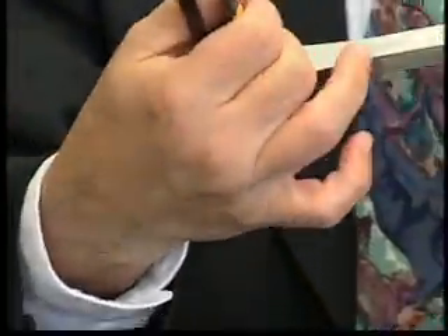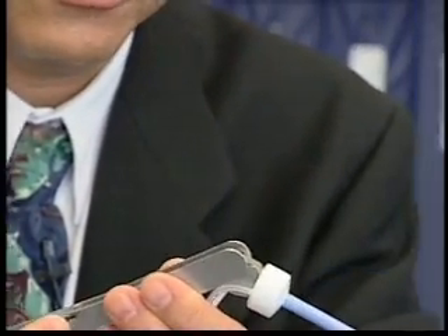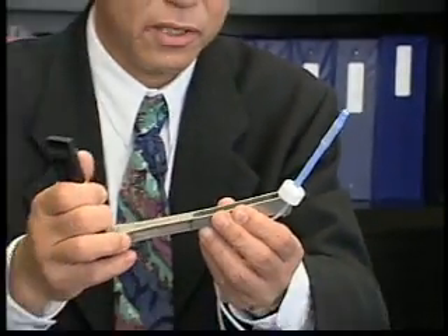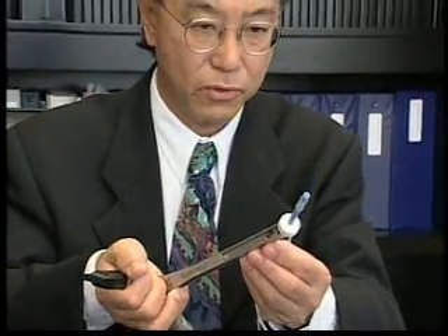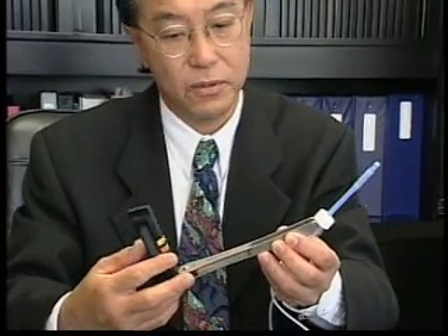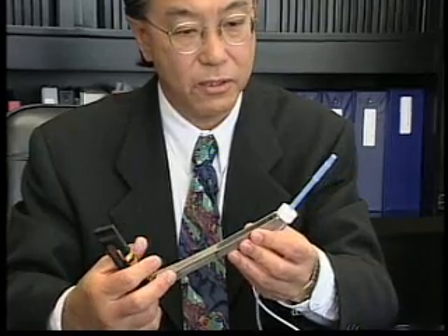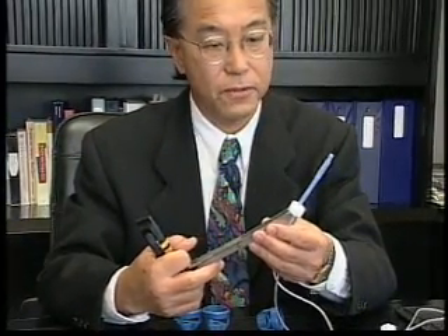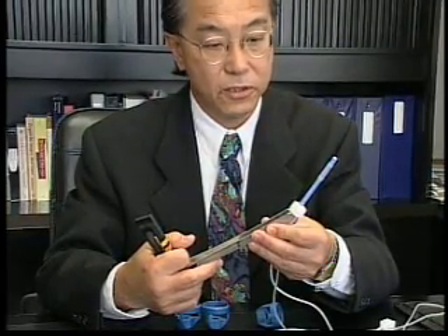This versatile uterine manipulator allows anteflexion and retroflexion of the uterus, and it also allows several degrees of freedom — one can push in, pull out, move to the right, or move to the left. This is used for all our laparoscopic operations, not only hysterectomy, and is particularly useful for endometriosis surgery and infertility surgery.